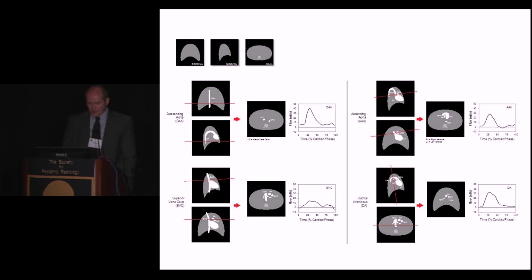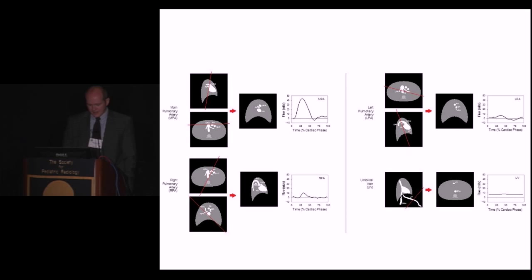This is achieved by acquiring two orthogonal views of the vessel and then aligning the imaging plane at right angles to the vessel. I made these figures to illustrate slice positions for fetal vessels, but they apply equally well for postnatal patients. Performing a phase contrast assessment in each of the major vessels provides a complete picture of the distribution of blood flow in the circulation, and the small extra time investment can be invaluable in cases where the hemodynamics are complicated.